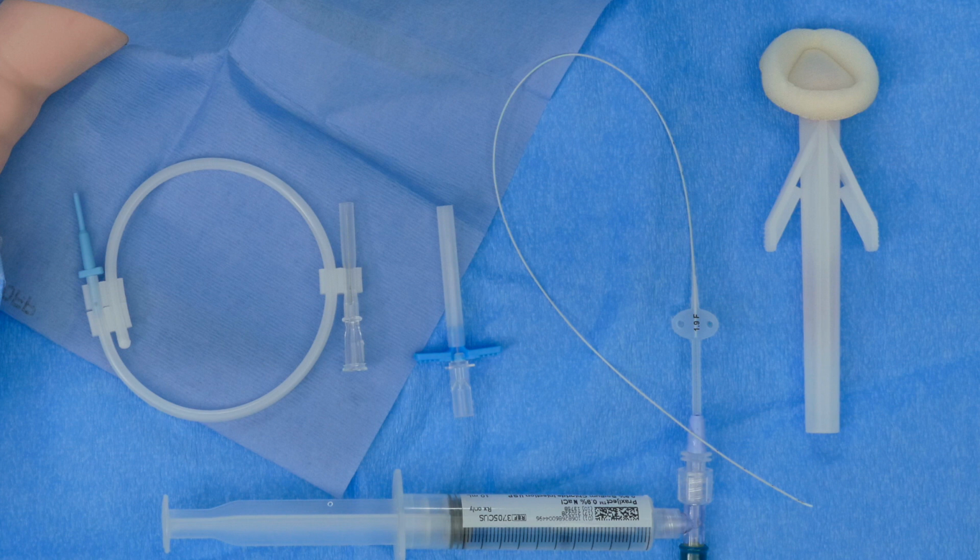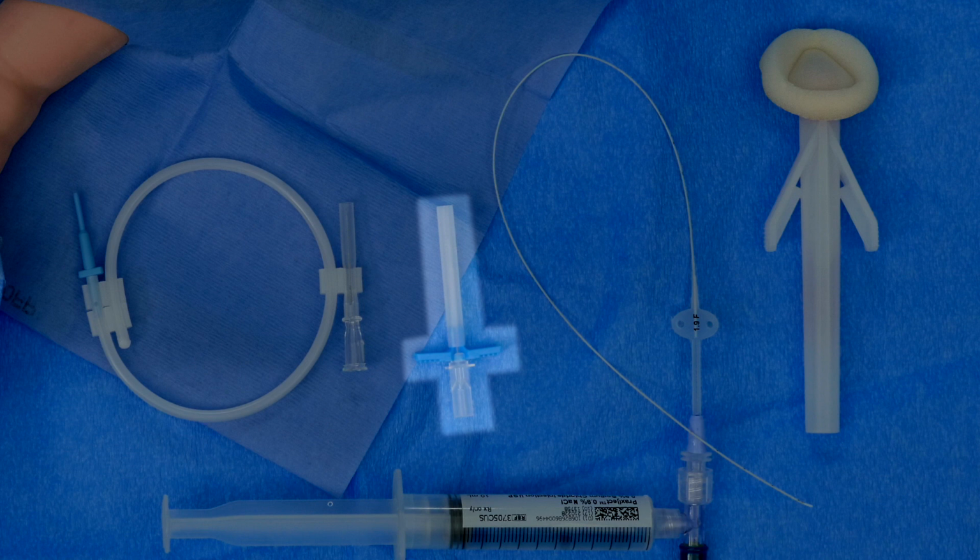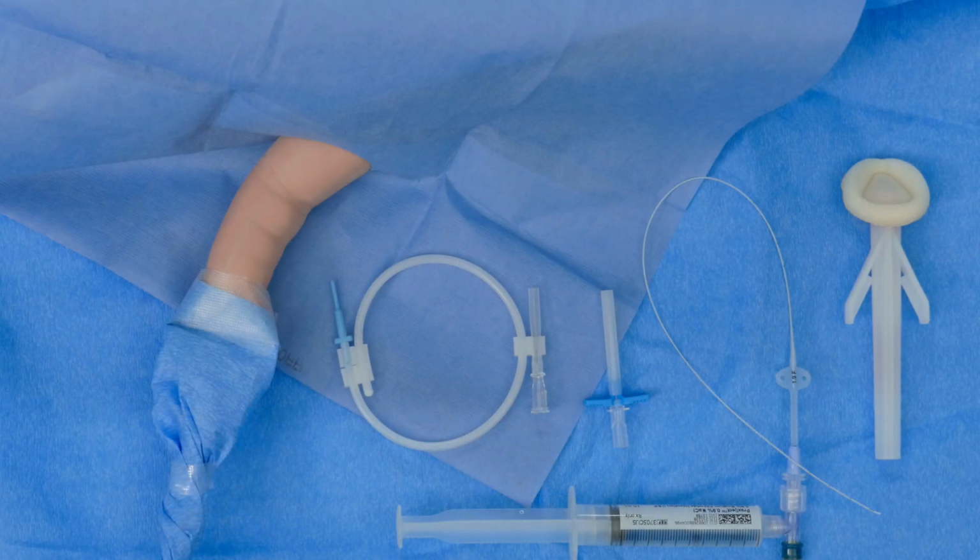The first step is to gather the supplies and equipment required for insertion of the selected device. This includes the MST kit. For this video, we will be using the 27 gauge introducer needle that comes in the kit. You may also use other small peripheral intravenous catheters that you are familiar with and commonly use for peripheral vascular access.